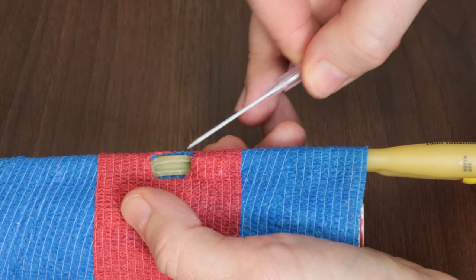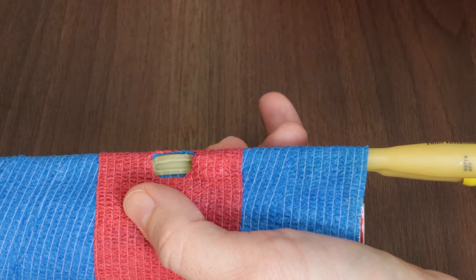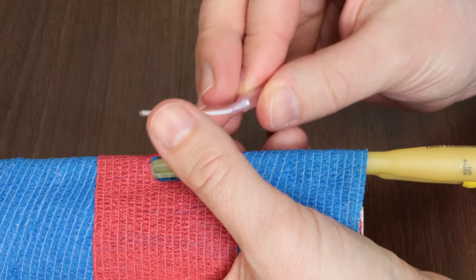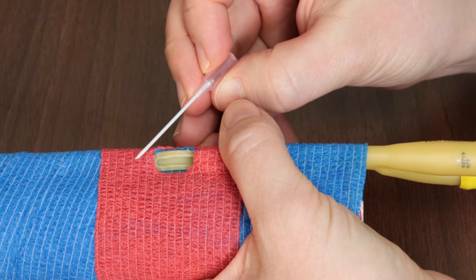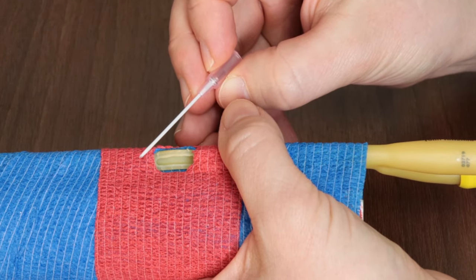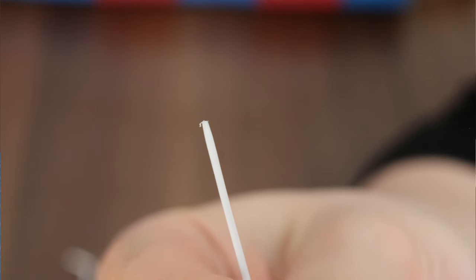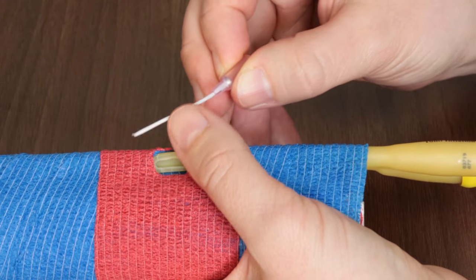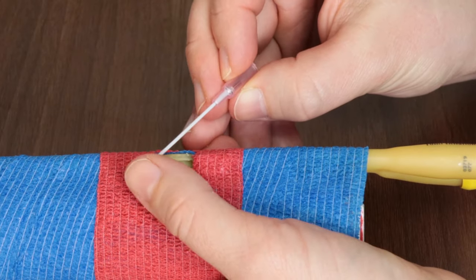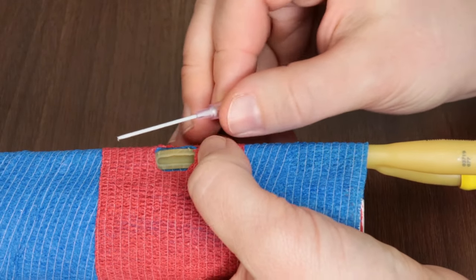The important thing that I want to show you here is that while a catheter is made of a soft and pliable material, if you take a really close look at the end there, now you can see from my mishap of running into structures, where the catheter did not feed smoothly into the vein, now I have this little burred edge. So even though this is soft and pliable, imagine having this little burred end, which actually feels a little roughened, inside your vein.